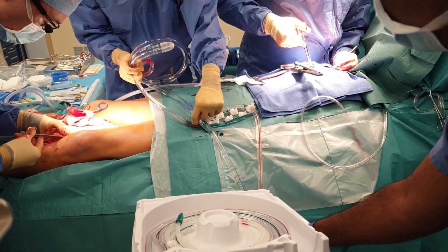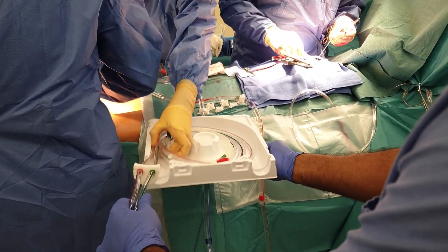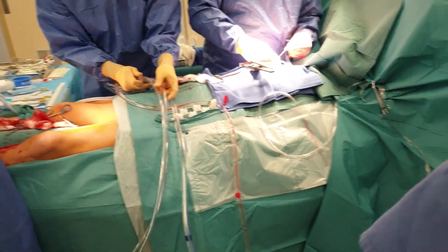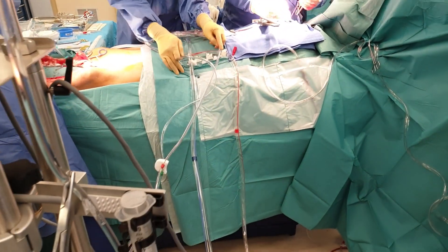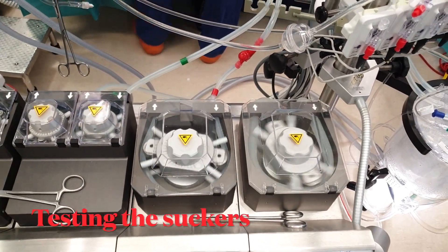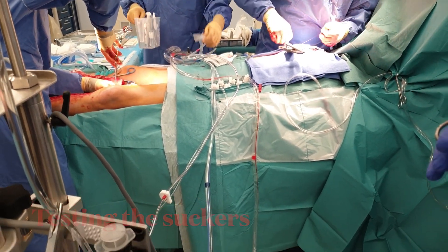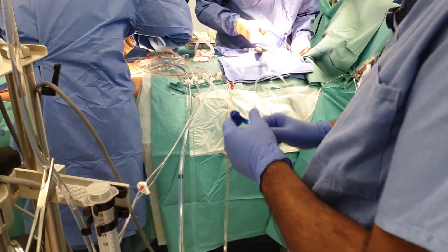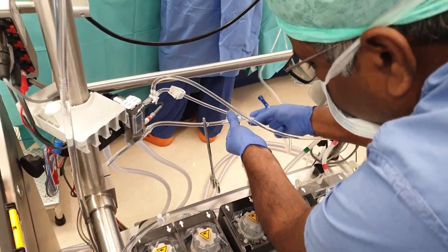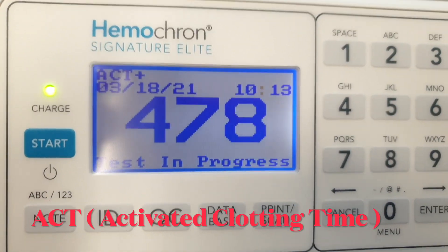Heparin is given at the rate of four milligram per kilogram. Heparin is an anticoagulant that prevents the formation of blood clots when the blood comes in contact with a foreign surface. That is why we have to maintain the ACT over 400 seconds throughout the case.